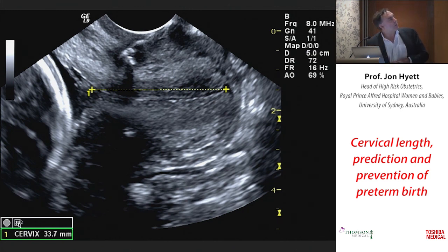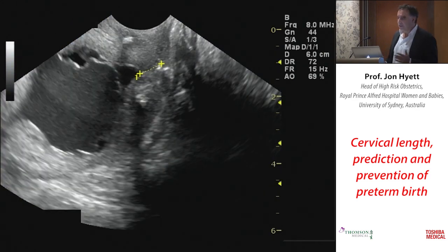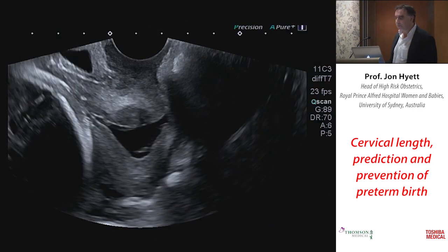So this is perhaps a slightly better placed stitch. This is the advantage of being able to look at your cervix with ultrasound after you've done the intervention. This cervix before the stitch was inserted was about 9 millimeters in length, and you can see 33 millimeters long at this point in time. This is an example of what happens with a rescue stitch. So you put the stitch in, you actually have pushed those membranes back, so you can see you've got membrane separation there behind the stitch, and you tend to get ruptured membranes at some point.